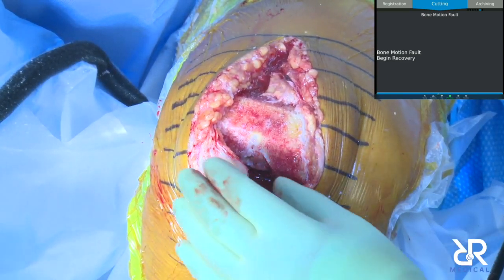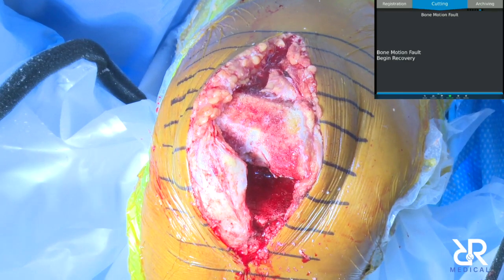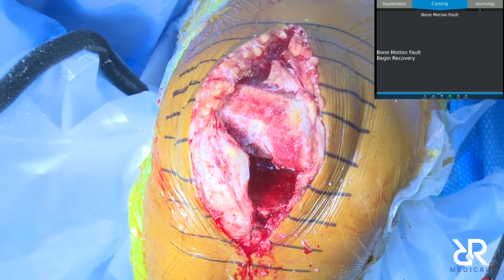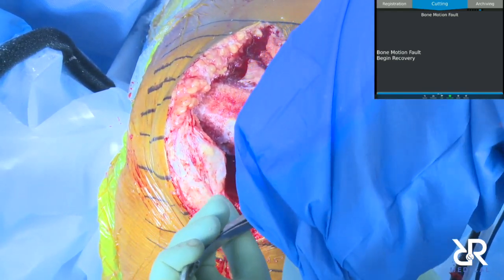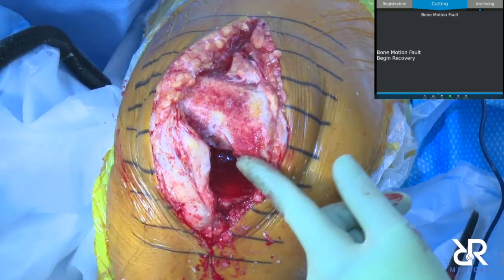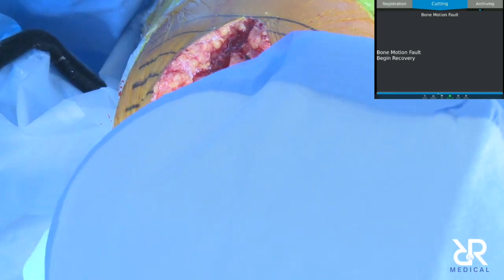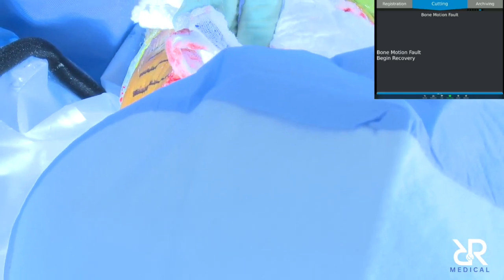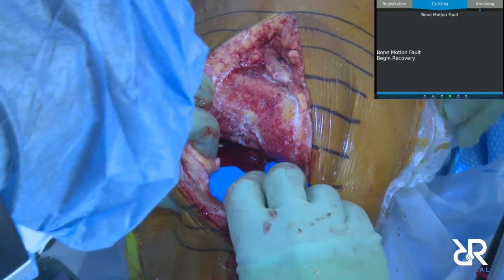Let me have a one tibia with the ultra congruent. This one comes in a one. No, this is the congruent. There should be a one like this. No, that's the CR. That's the ultra congruent. Brian, do we have an ultra congruent poly? That's 11. Let's just do 11. That's fine.